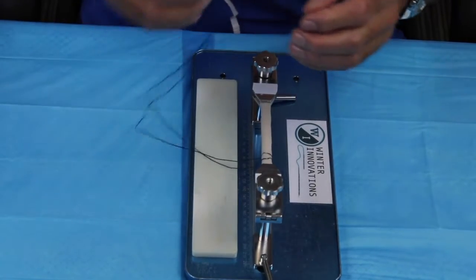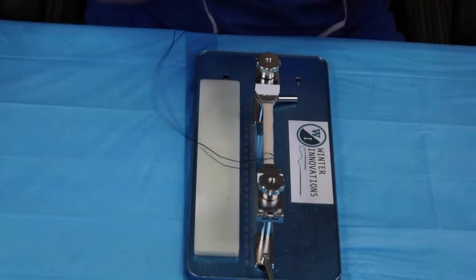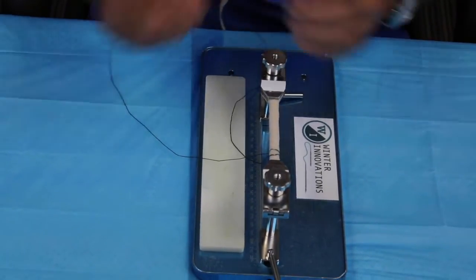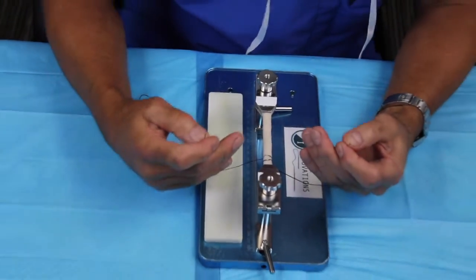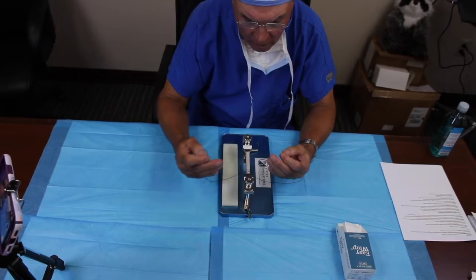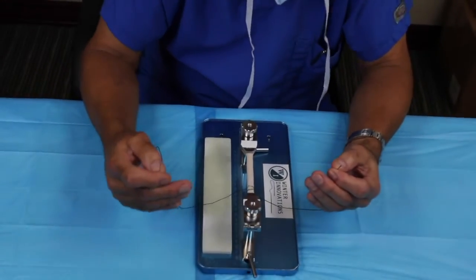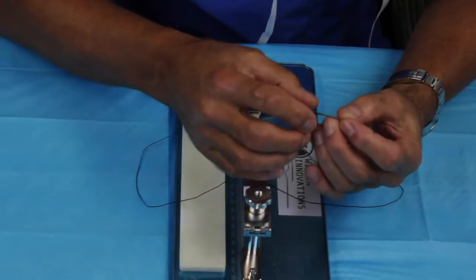So then there is a modification that I particularly like, because sometimes when you do these whip stitches, what happens is they shred the tendon a little bit. So you want to distribute the force over the tendon in a different manner so that doesn't happen. And there is a way to do that.